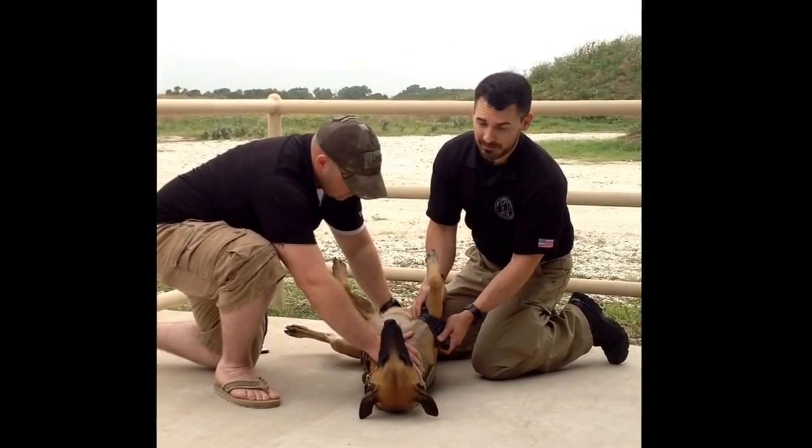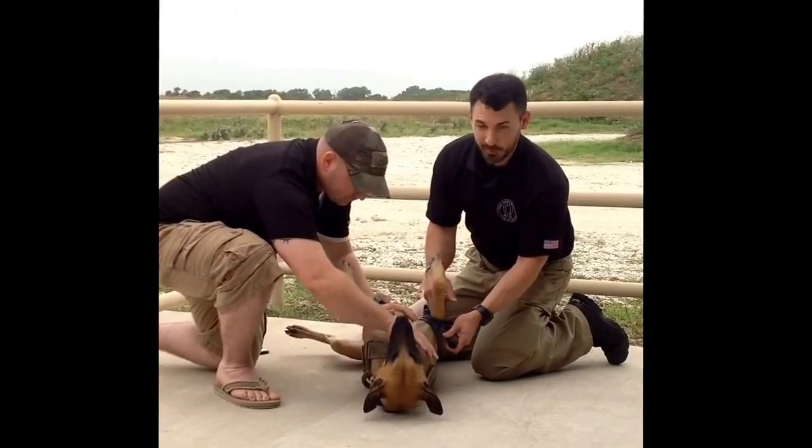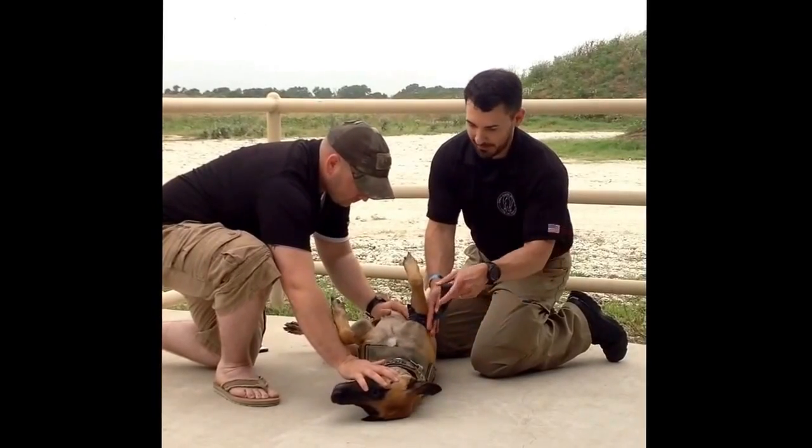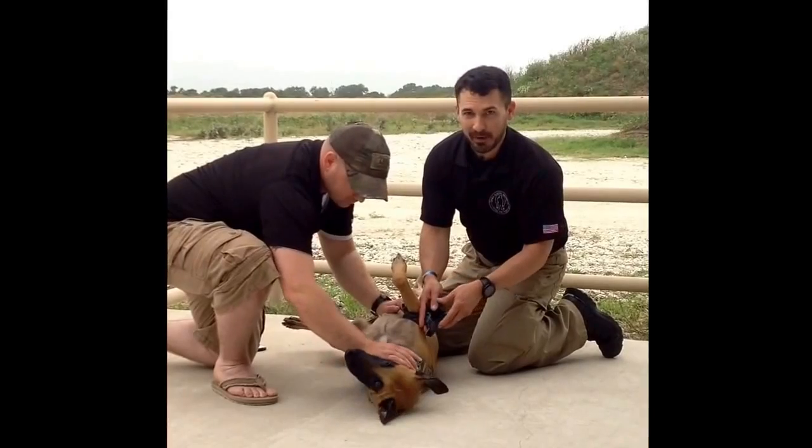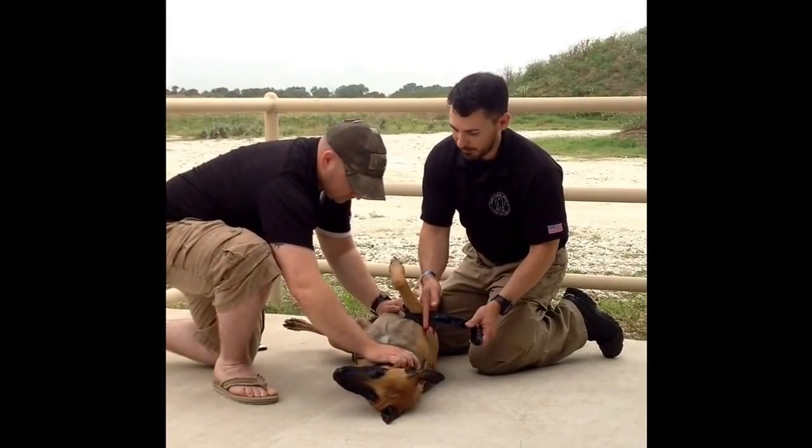With a dog in an altered mental status, they're going to try to snap and bite a little bit, so we're going to keep the business end taken care of, like Adam's doing. We can also cut this tourniquet in half, wrap it around, and make an improvised muzzle — and while they've got good airflow, they're good to go.